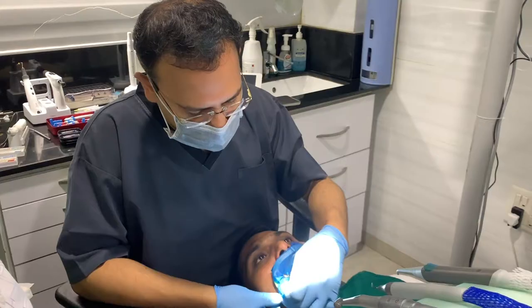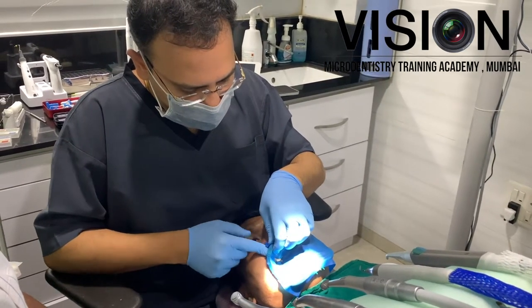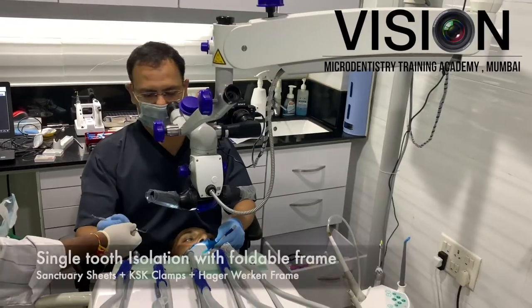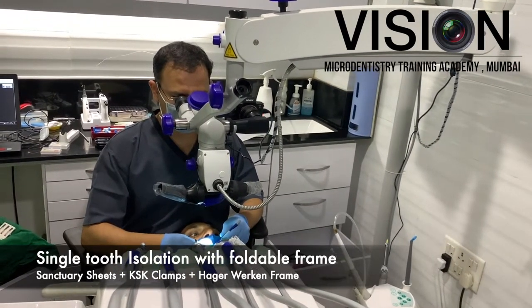This was a case performed as part of a live demonstration for the Endovision Course 3 at the Vision Micro Dentistry Training Academy. It was a maxillary second premolar referred to me by a colleague for separated instrument retrieval.